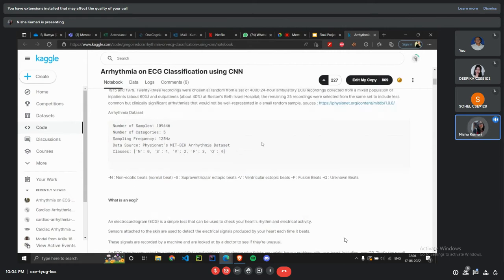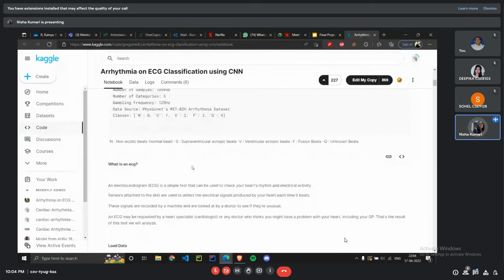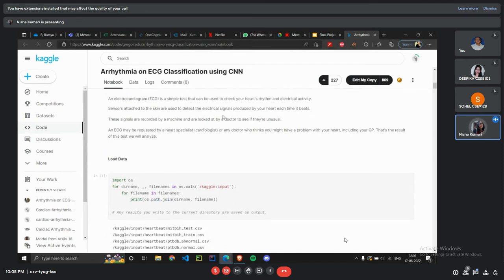The number of samples that we are working on currently is 109,446, and we have taken into consideration five categories, and our sampling frequency is 125 hertz. The data set source, as we already mentioned, is PhysioNet's MIT-BIH arrhythmia data set. Here we have named our five classes as N, S, V, F and Q, where N stands for non-ectopic beats, S stands for supraventricular ectopic beats, V stands for ventricular ectopic beats, F stands for fusion beats, and Q stands for unknown beats. We have numbered them accordingly, where N is 0, S is 1, V is 2, F is 3, and Q is 4. So what is an ECG? An ECG is a simple test that can be used to check your heart's rhythm and electrical activity.